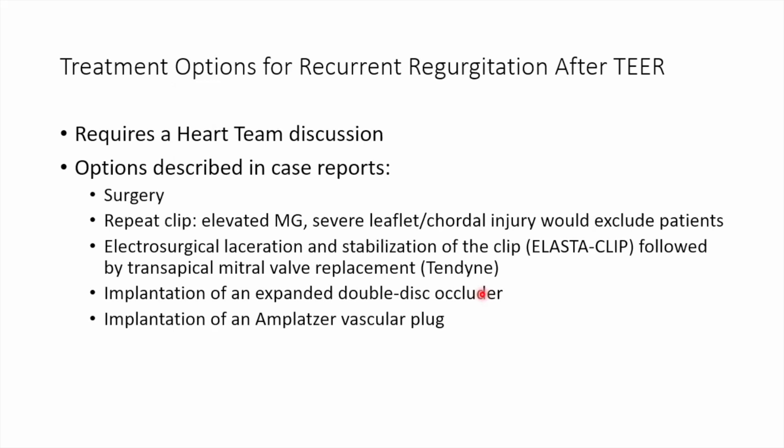So there are a couple of treatment options if you do develop regurgitation, but at the end of the day, this really requires a heart team discussion. These patients are obviously too high risk for surgery, so surgery is often not an option. There have been cases of repeating that clip, as you've seen, with good success.